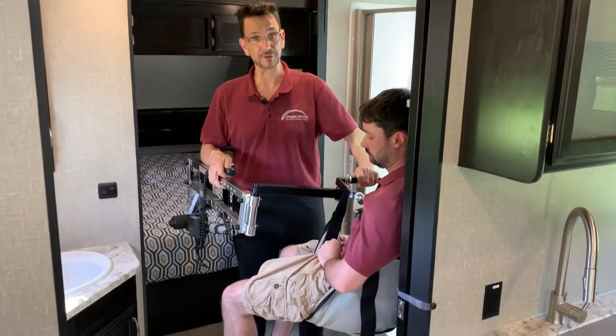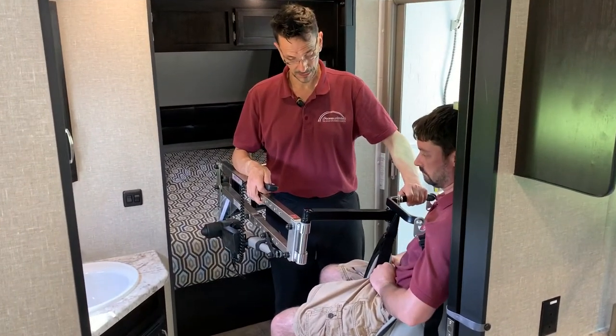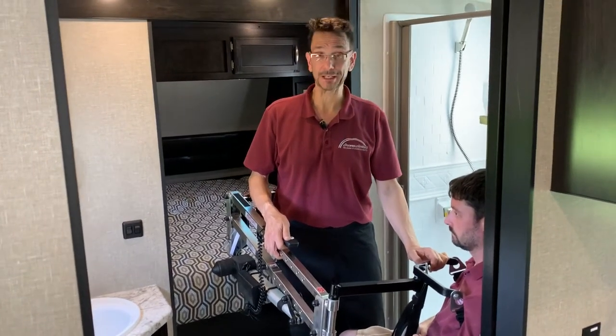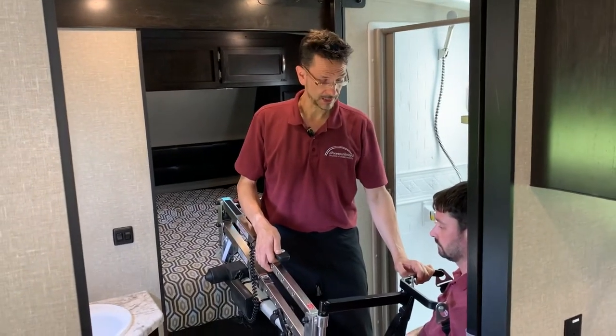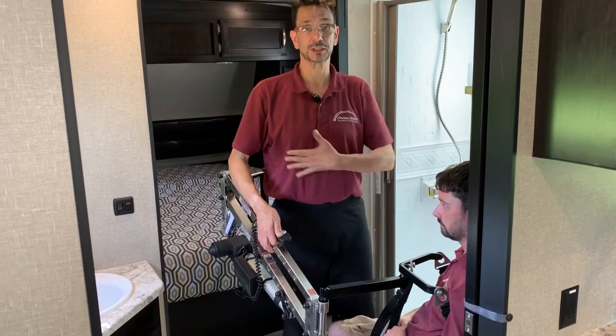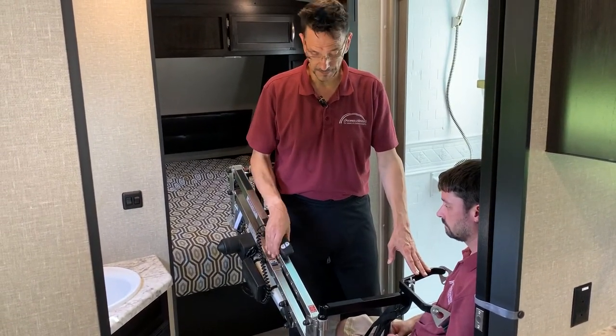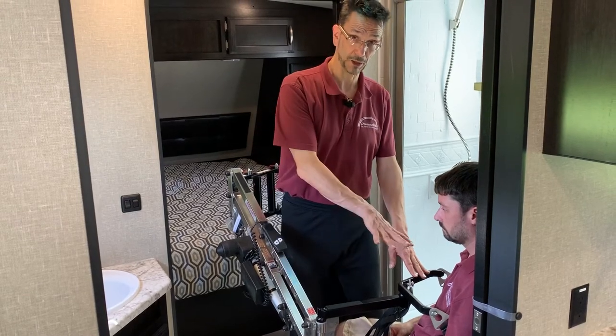Here we go, lowering down onto the toilet. We also have a great sling called the combo sling, which is for getting your pants down — a special sling that actually lifts you from the upper torso. Lots of different solutions there. Now we're on the toilet taking care of business.